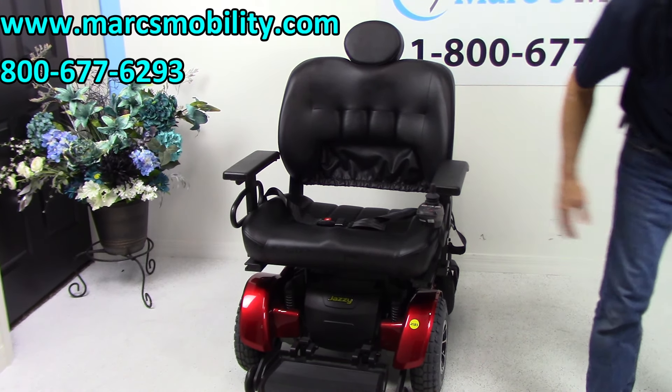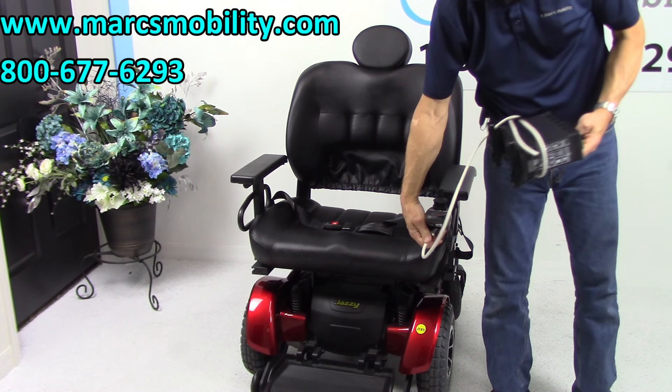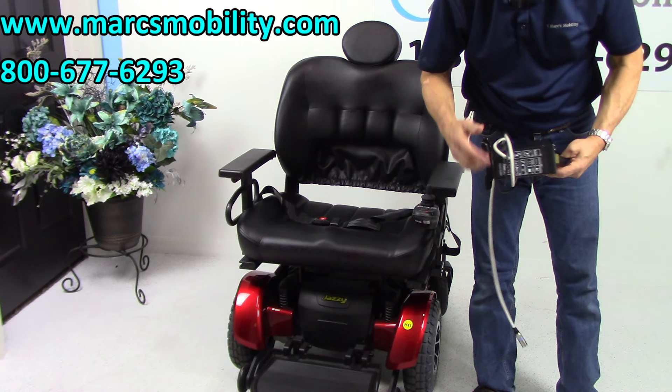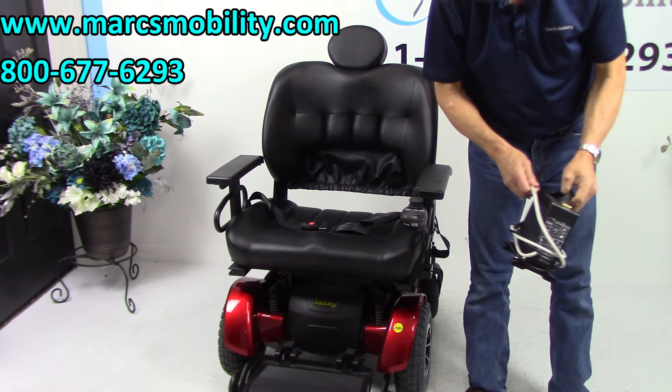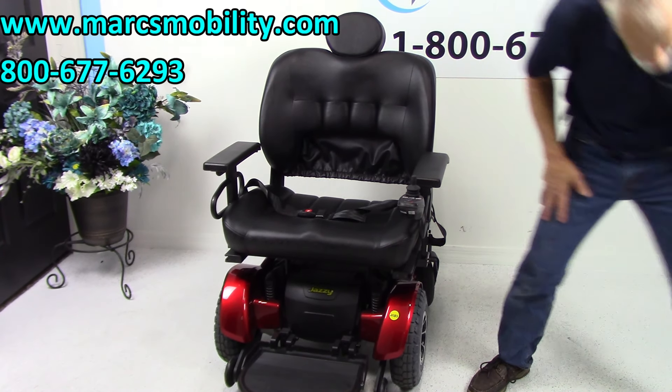When you charge the batteries, you take your charger and plug it in below the joystick. As soon as the light goes green on the charger, it will stop charging automatically — the charger knows when to stop. When the batteries are full, the charger stops.